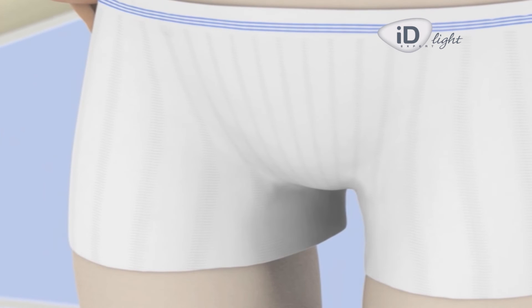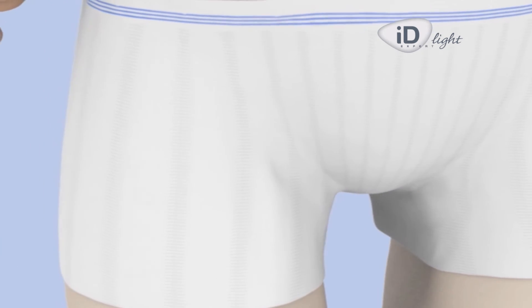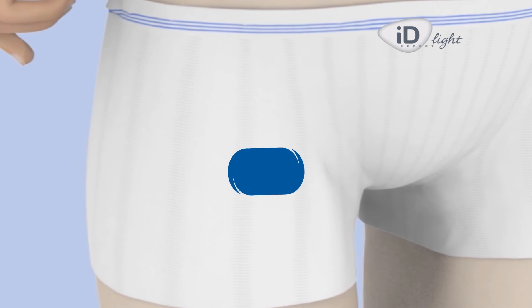Roll up the underwear and adjust it for optimum comfort and safety. An undergarment worn close to the body will bring total effectiveness to this type of product.